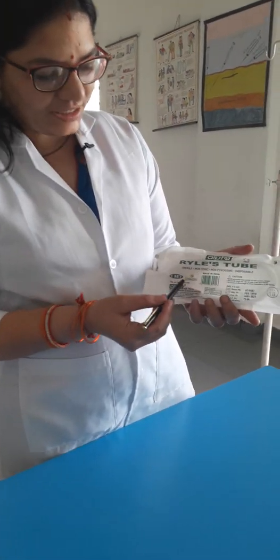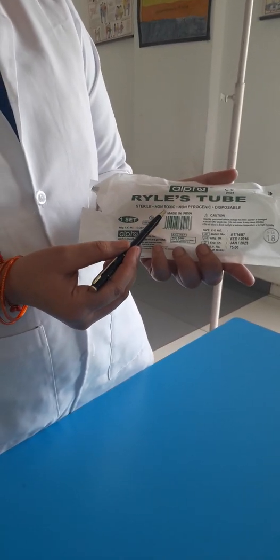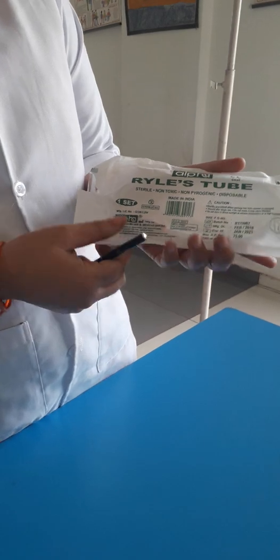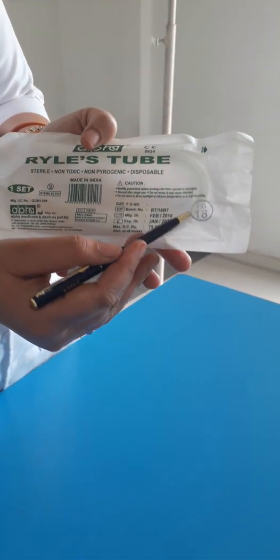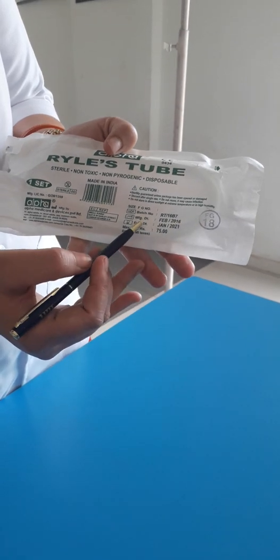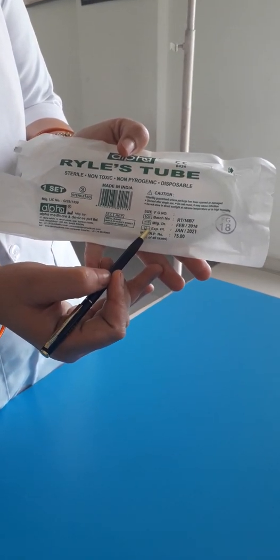It is also known as the nasogastric tube. As you can see, it is written that it is sterile by ethylene oxide. It is non-toxic, non-pyrogenic, and disposable. Here you can see the size is written — it is size 18, FG means French gauge. You also have to check the manufacturing date as well as the expiry date.